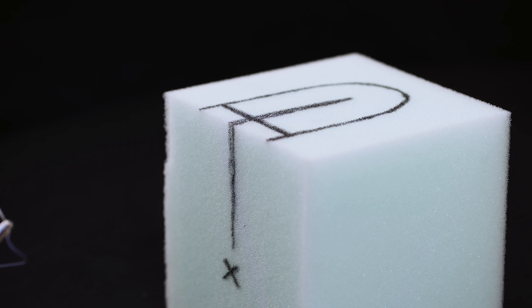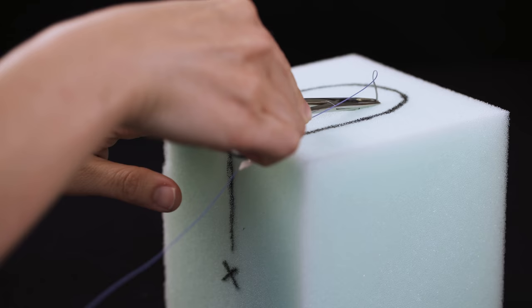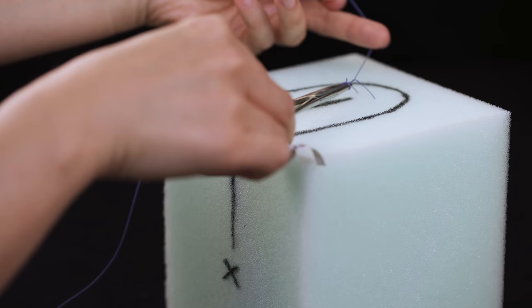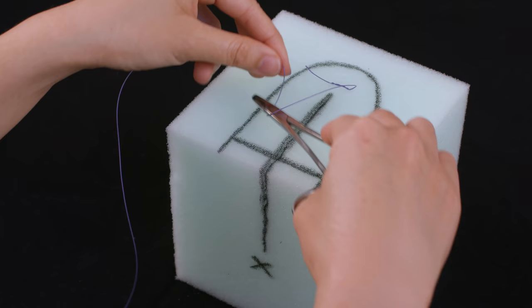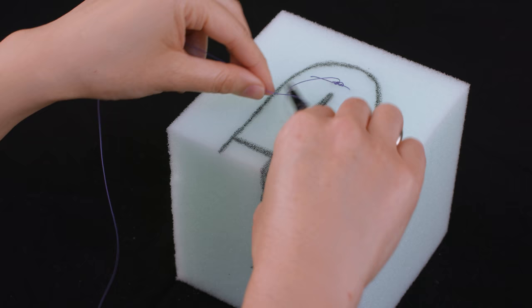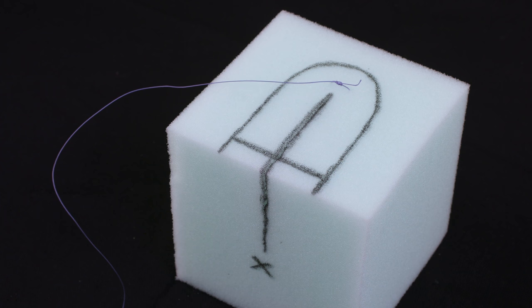Place your anchoring suture one centimeter above the apex of the laceration. In this demonstration, I will be using instrument ties, but in real life you should do one-handed ties. It's a good idea to practice these prior to your surgical rotation. I won't make my knots too tight here because it will tear the foam. However, in real life, your sutures should be secure and square. For braided sutures, three or four square knots are enough.